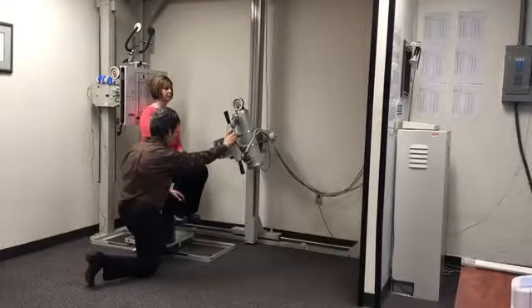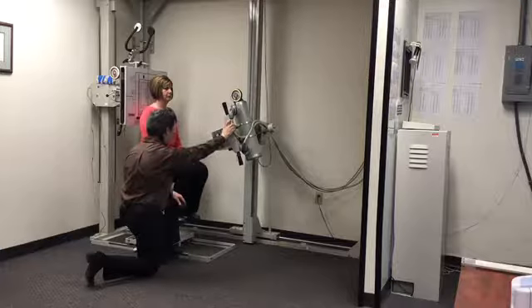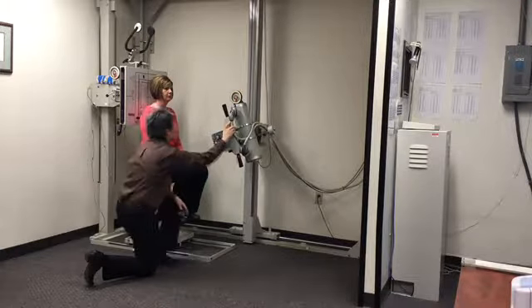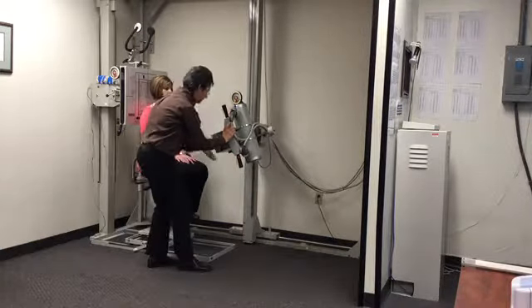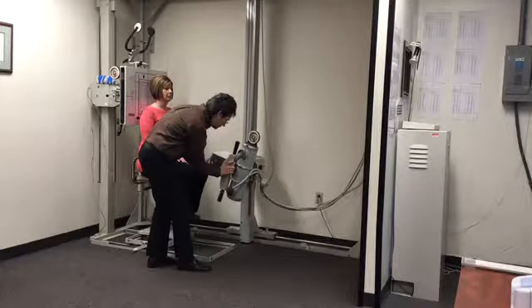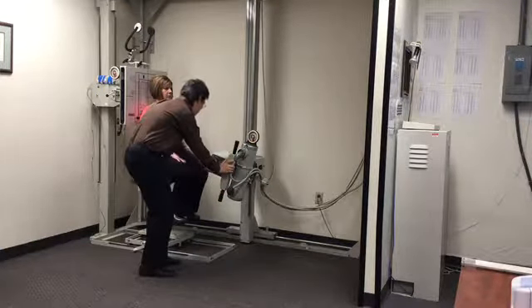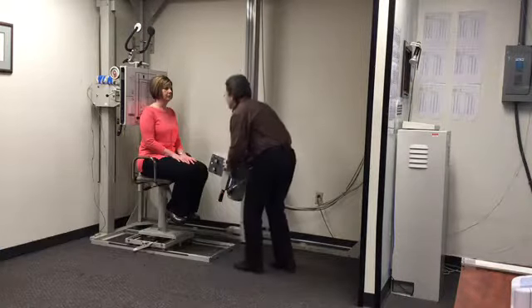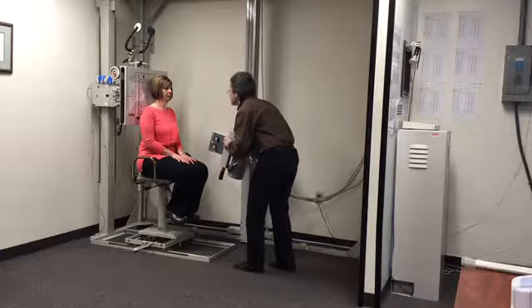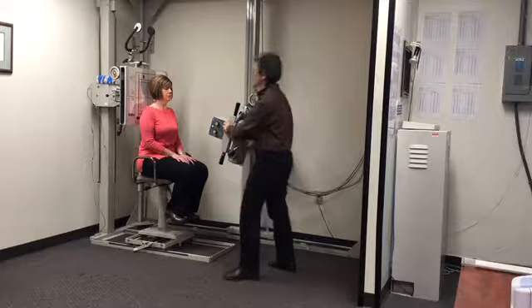We're going to bring our tube in to a 40 FFD, so the arrow on the tube matches the 40 FFD position on the tube track. We need to set our tube angle at 15 degrees cephalad, so the white needle hangs on 15 on the gauge. I'm going to open up collimation. And I'm going to raise the tube until the horizontal beam passes through C4. Okay, C4, mid-neck.